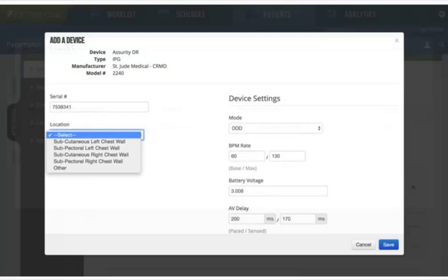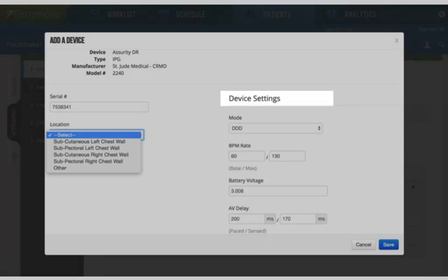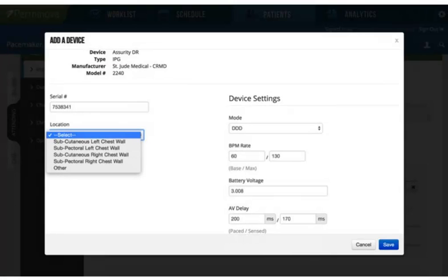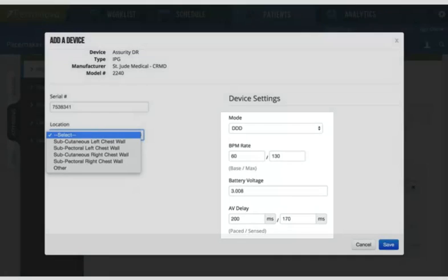Next, users indicate the implant location and confirm the device settings. All the data displayed here is pulled from the file uploaded from the device programmer.